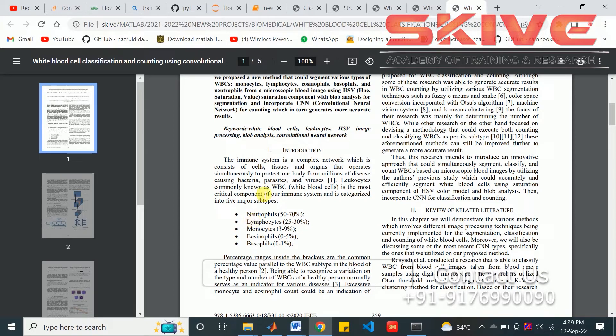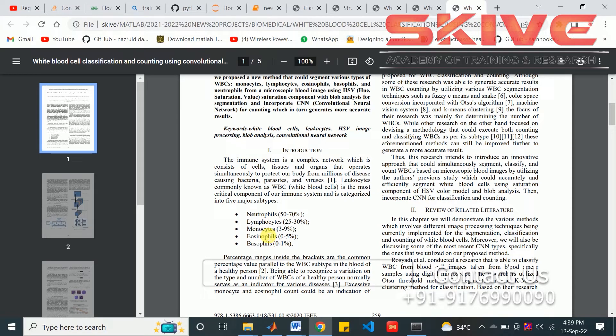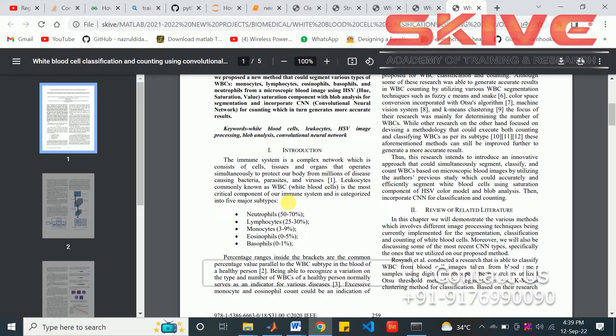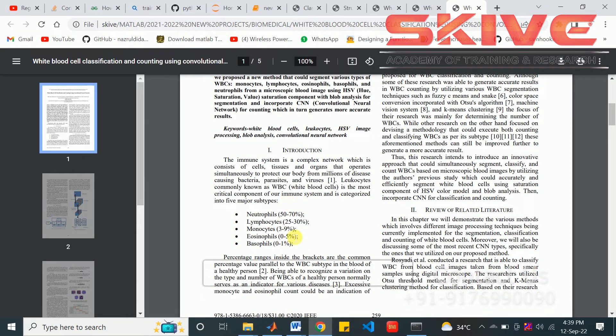After getting the dataset of the blood cells, we have to classify it using this convolutional neural network. Before that, some preprocessing steps and the segmentation process will be applied on the image.